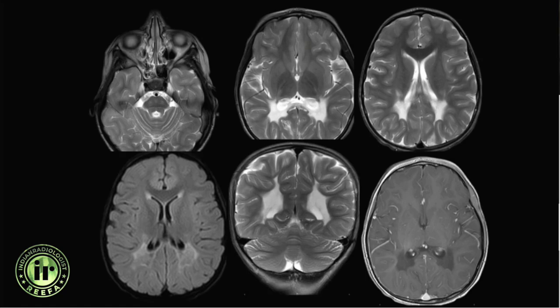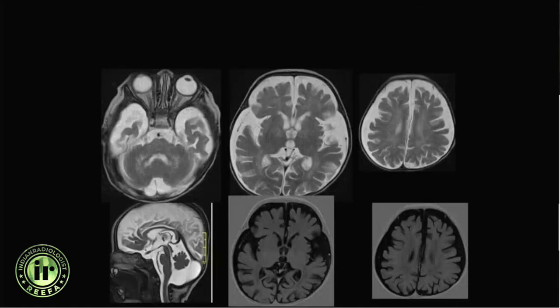Another patient — a girl with delayed development and scholastic impairment — shows peritrigonal signal abnormality in the same location as ALD. However, because this is a girl, this is Krabbe's disease. The Loes score is important to calculate in this context. Both juvenile Krabbe's and other leukodystrophies must be differentiated.